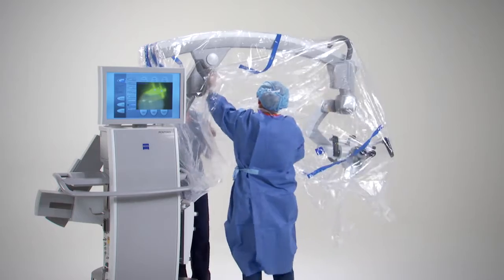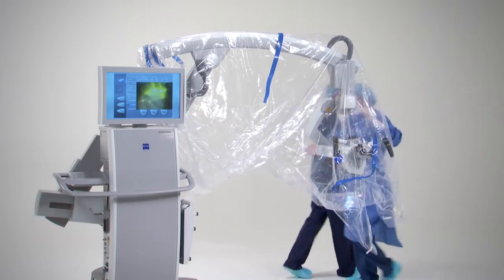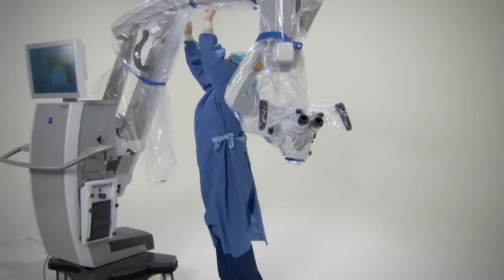Make sure that there is slack in the drape to allow for swivel, tilt, and rotation of the microscope, especially around the handgrips. Pull the drape over the rest of the arm. Using one of the straps, make the drape airtight at the farthest position.